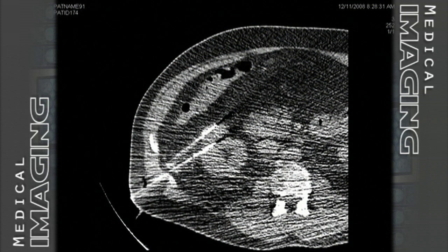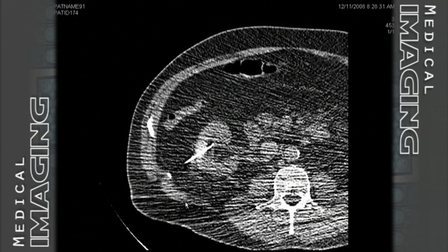This procedure at this point has probably taken the better part of an hour and a half to do. The needles are advanced in a very slow fashion, and numerous CT images are taken to see where the needles are going. This is necessary so that you don't enter bowel or vessels, which could further complicate the exam. There are several more CT scans to further localize the needle.